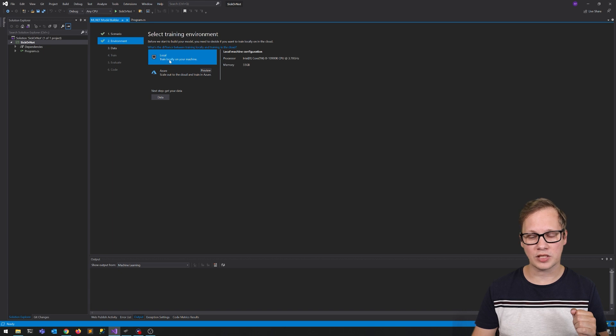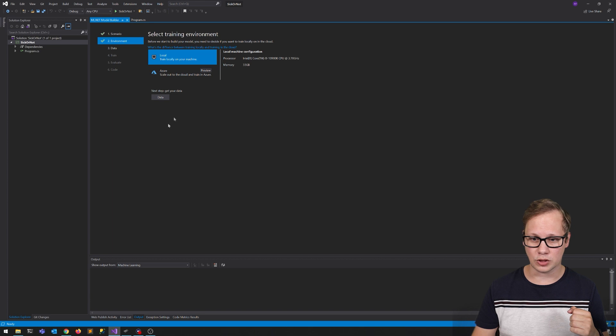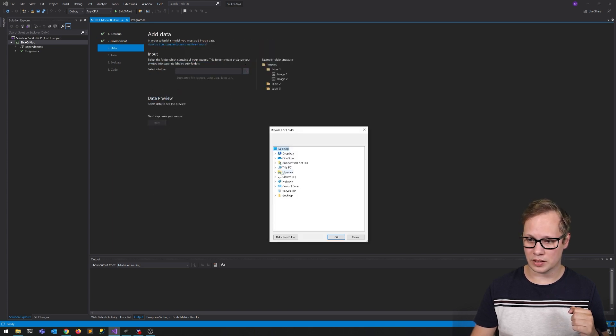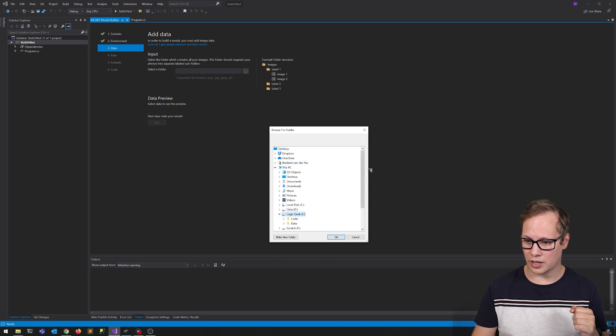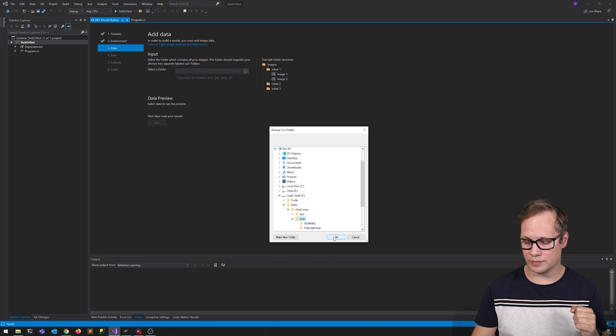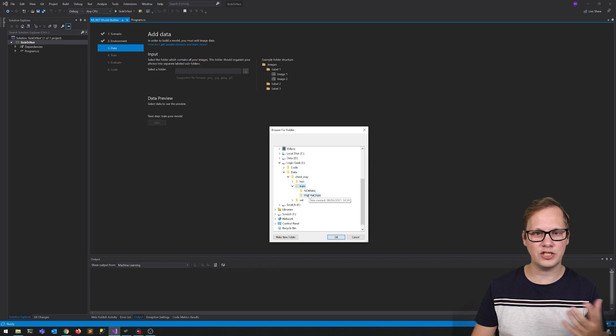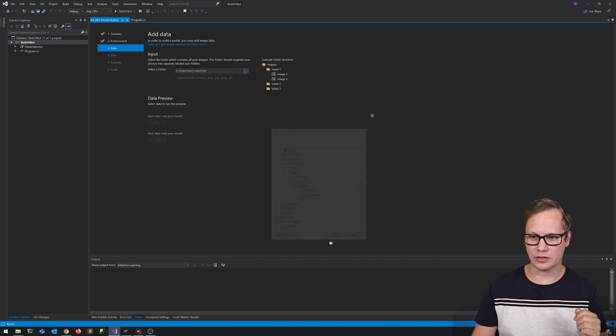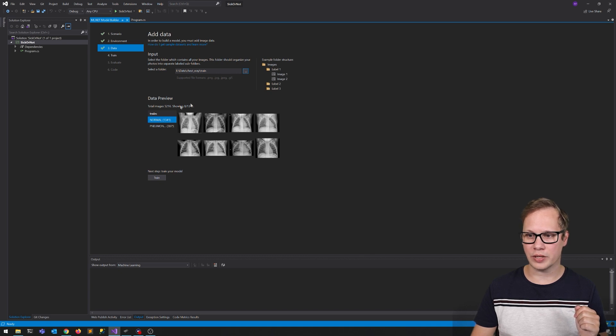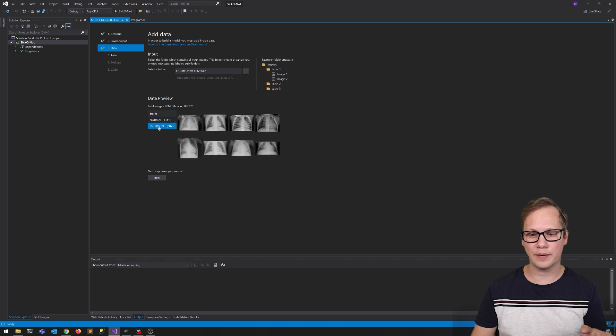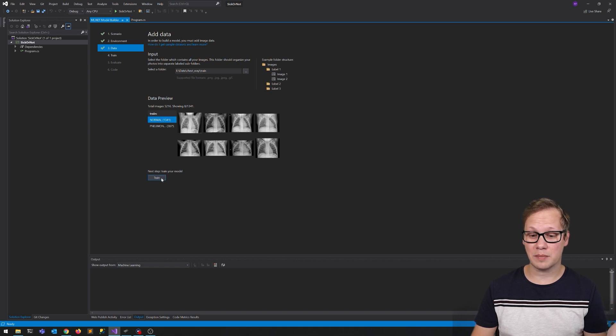I'm going to say I'm going to run this local. I can also choose Azure instead of a workspace there, but I'm just going to do local. Then I'm going to select my data. It's in my Logic Geek drive data chest X-ray train. You need to select a folder where each label, each type, is a separate subfolder containing the images. It detects normal and pneumonia with some sample images. And then it's just a matter of clicking Train.